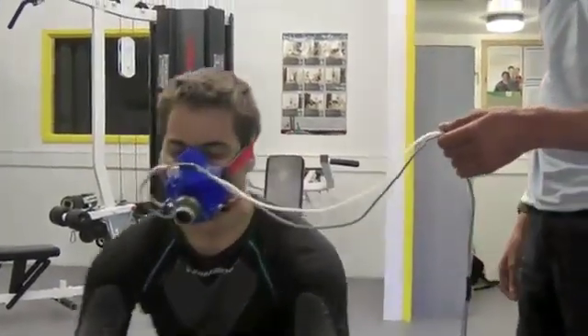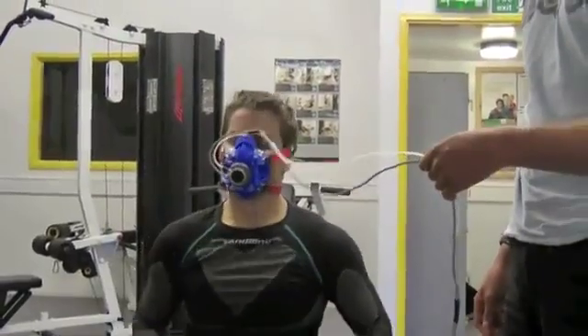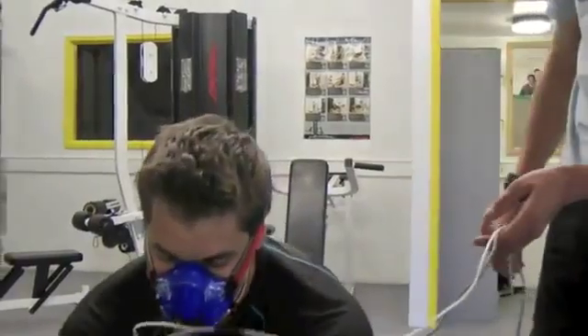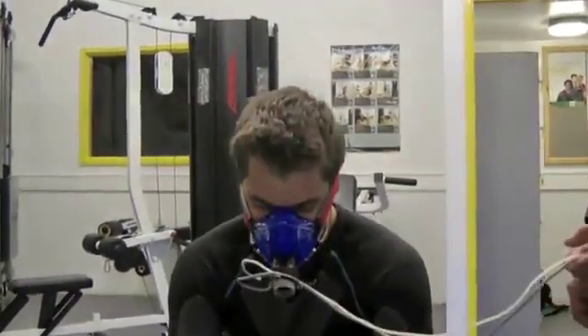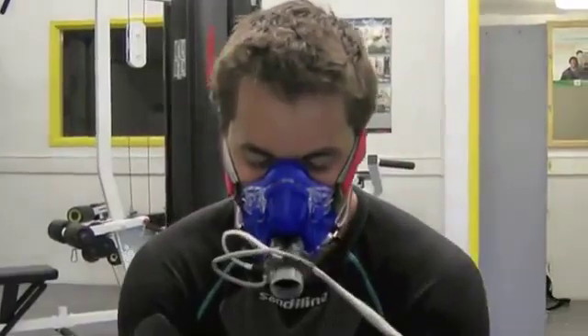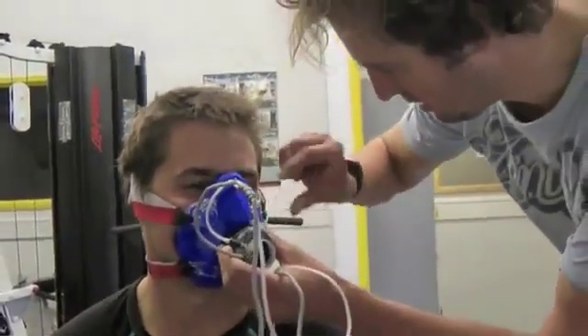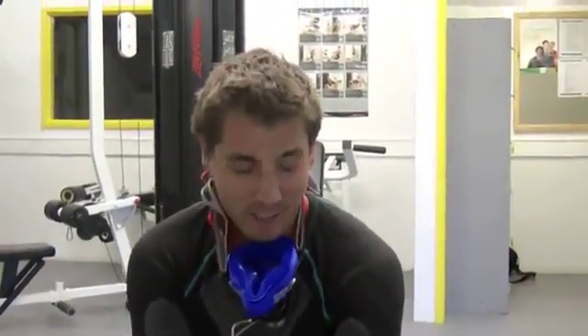Well done, Marion. You all right? Good effort. Okay, you can put the handle back if you want to and just slide your legs. How are you feeling? Do you want to take the mask off? Yeah, just take it off there. How was that, Marion? Dizzy. Good, well done.